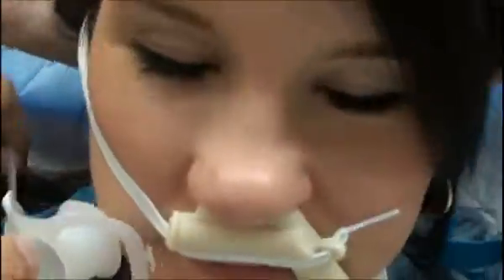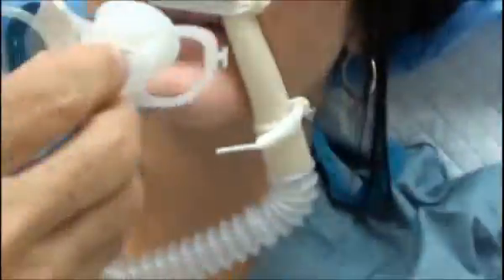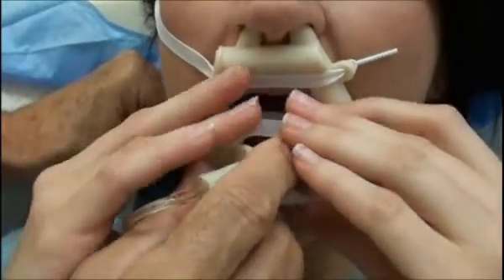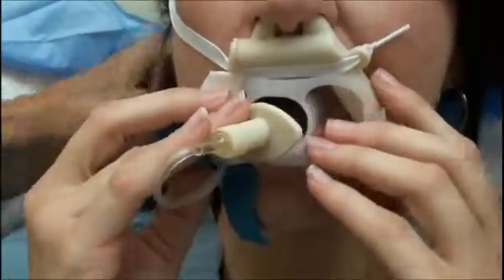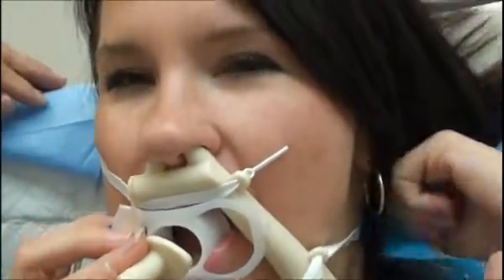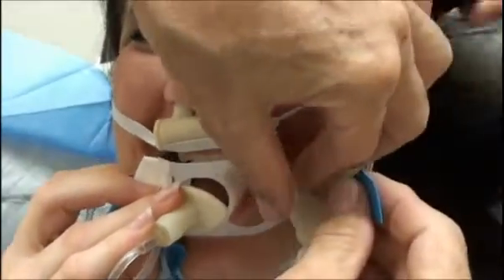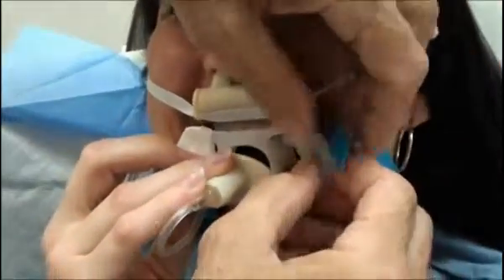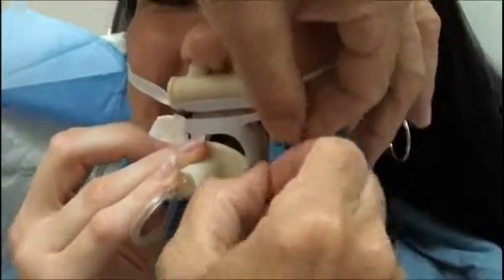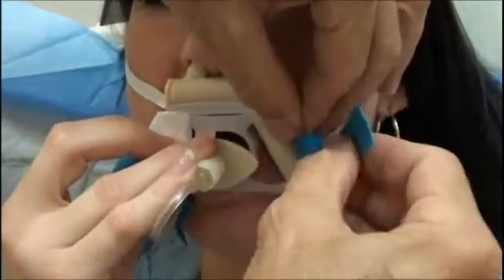Can you open your mouth? You've got such a tiny mouth you may not be able to bite down on this. Can you put it in? Just put it between your teeth and hold it there loosely. It's a lot of stuff in the mouth, huh? I used a strap from the bite block to hold it in place a little bit.